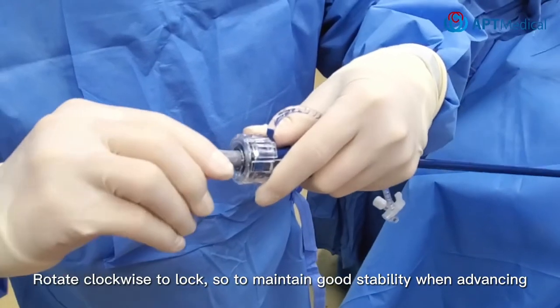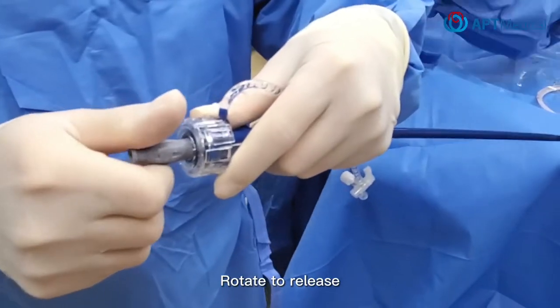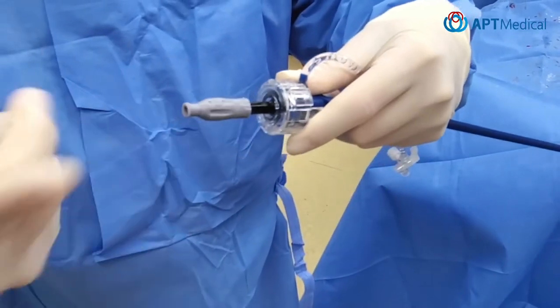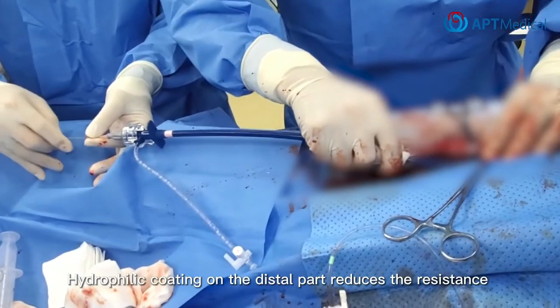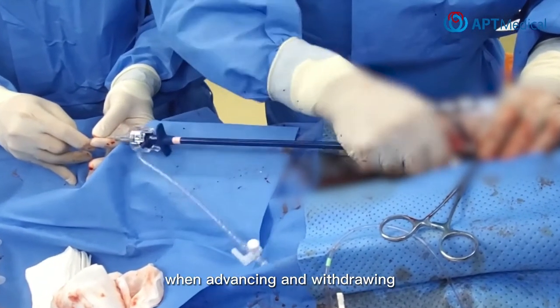Rotate clockwise to lock, so as to maintain good stability when advancing. Rotate to release. Hydrophilic coating on the distal part reduces the resistance when advancing and withdrawing.